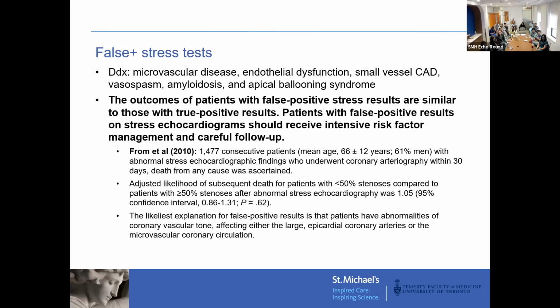But when you did reactive testing, they actually had vasospasm, and those vasospastic changes were bad enough that their overall mortality was pretty similar between obstructive disease and non-obstructive disease. So again, important finding that if you have a false positive stress test, they should receive intensive risk factor management and very careful follow-up, and not to just think that they are low risk.